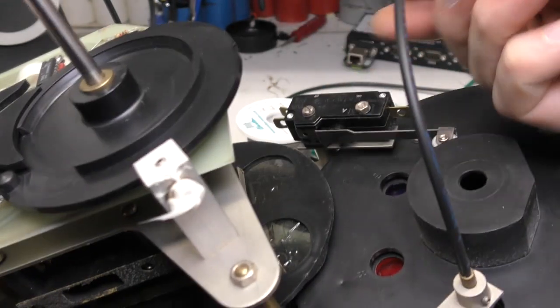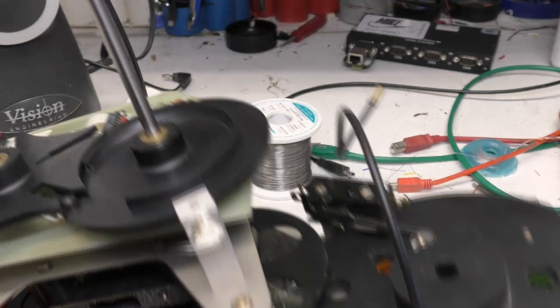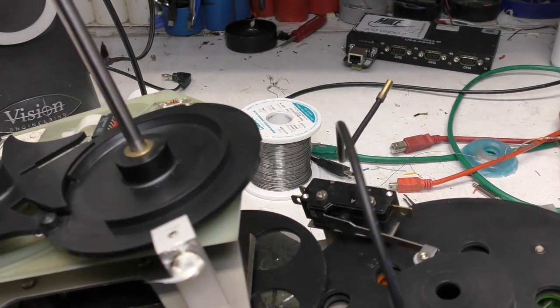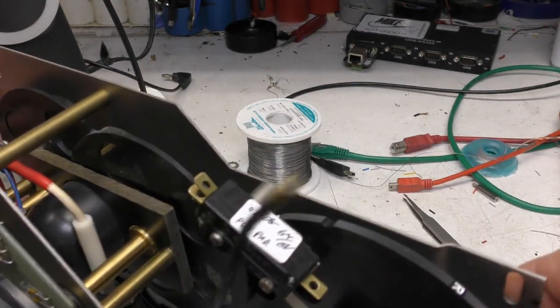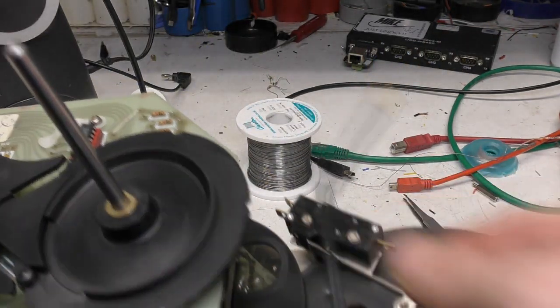And here we can see this one where we're just giving an indication through this fibre optic to that front panel control, which does seem a slightly ridiculous way of doing it. What's weird is you've got three different settings. We've got the density, the colour and the pattern selected, and they're all indicated in completely different ways on the front panel. So these ones, yeah, it does have the red, green and blue on the wheel, so it seems a bit of overkill just to repeat that colour on the front panel.